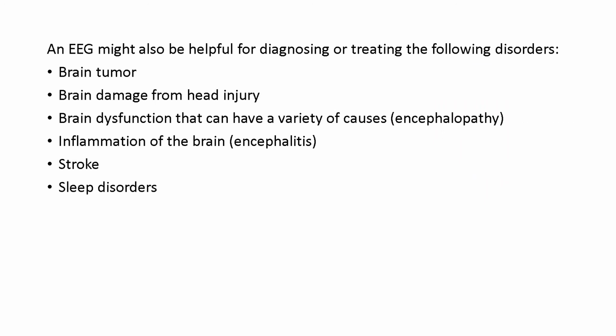It is helpful for diagnosing or treating the following disorders, especially epilepsy or other seizure disorders, brain tumor, brain damage from head injury, brain dysfunction that can have a variety of causes, inflammation of the brain, stroke, or sleep disorders.